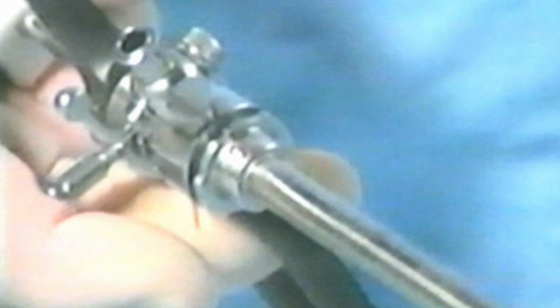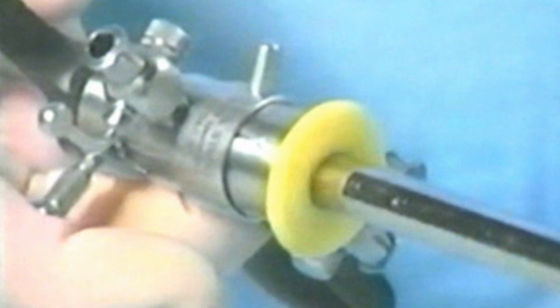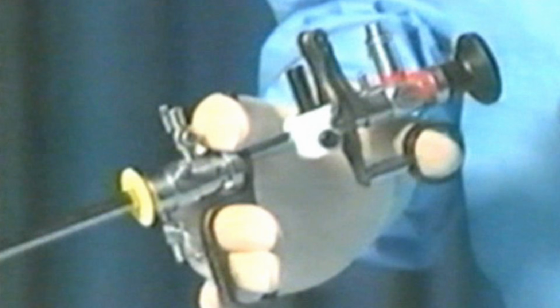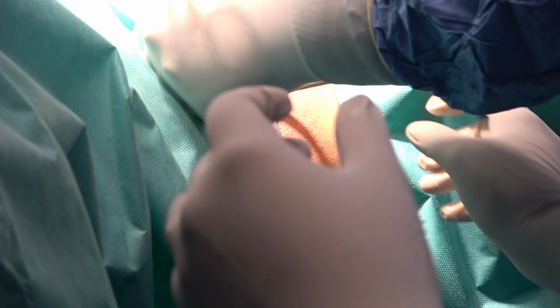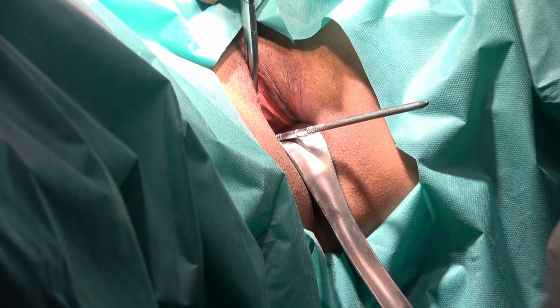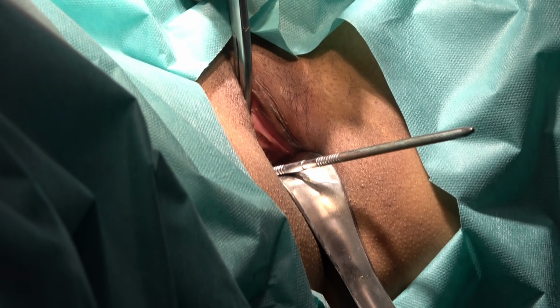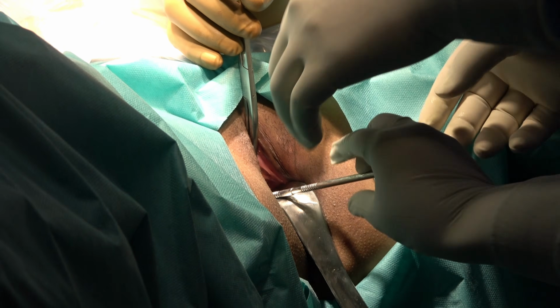So this is the outer sheath which will be attached, and then at last you will introduce the telescope. Once the telescope is introduced, now this resectoscope is ready. There are 2 types of resectoscope, active as well as passive. So we have fixed the resectoscope now, and now we will dilate the cervix with the number 5 Hager dilator. And if you are doing operative, you may have to dilate up to number 9 Hager dilator.